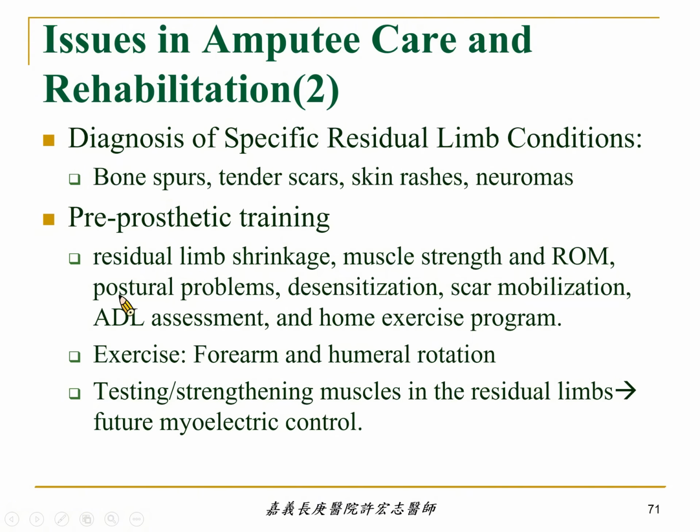And postural problems are also important. If our patient is suffering from scoliosis or kyphosis, he or she will not perform well using a figure-of-8 strap. So we should also correct these problems before we do prosthetic training.